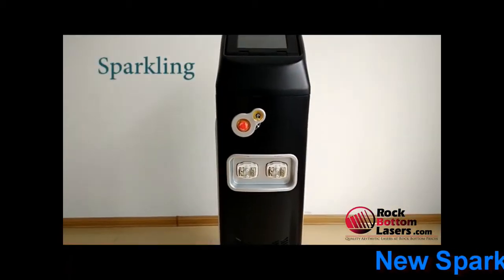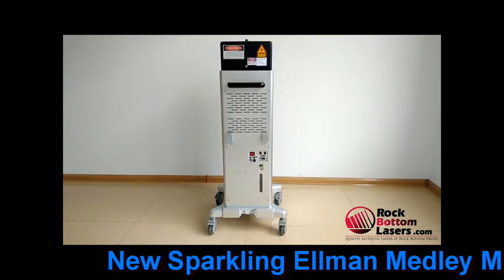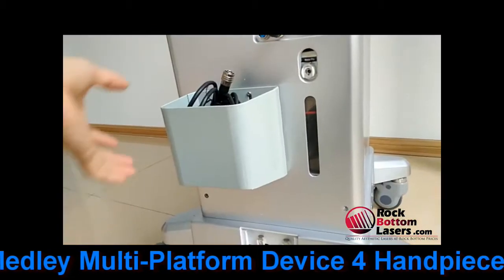Hi folks, Finn Wells here with rockbottomlasers.com. What I've got featured today is a brand new Elmen Medley sparkling multi-platform device.